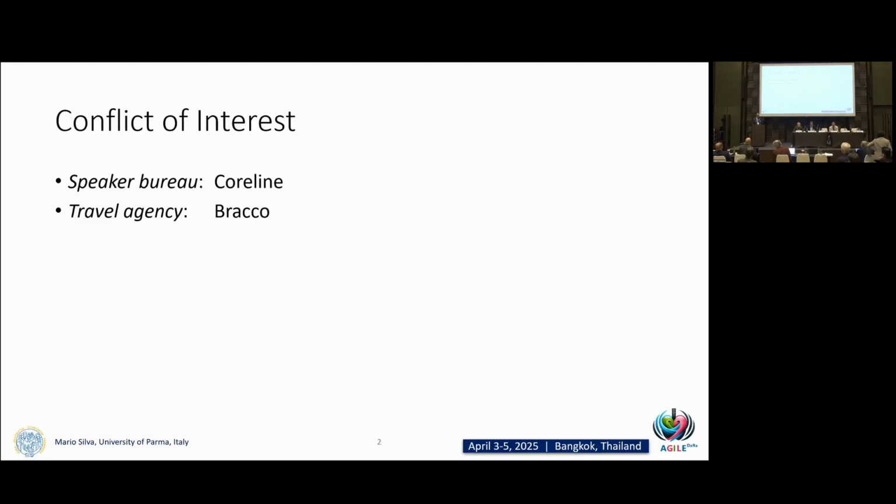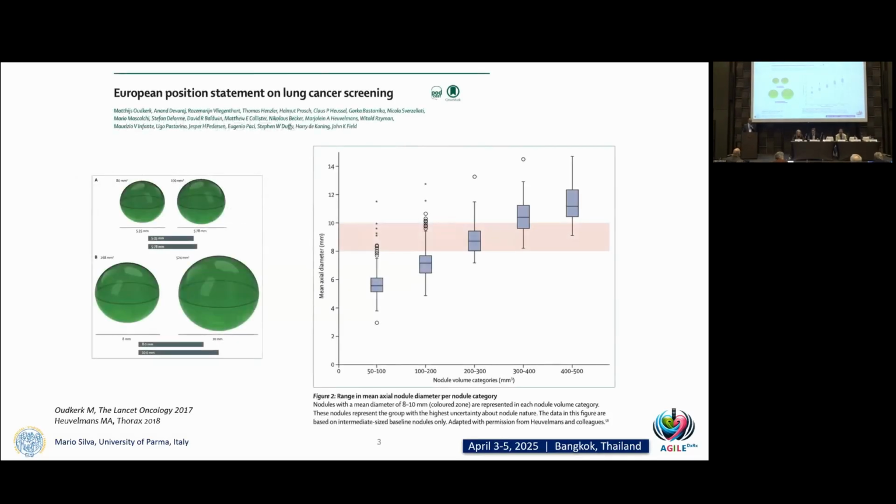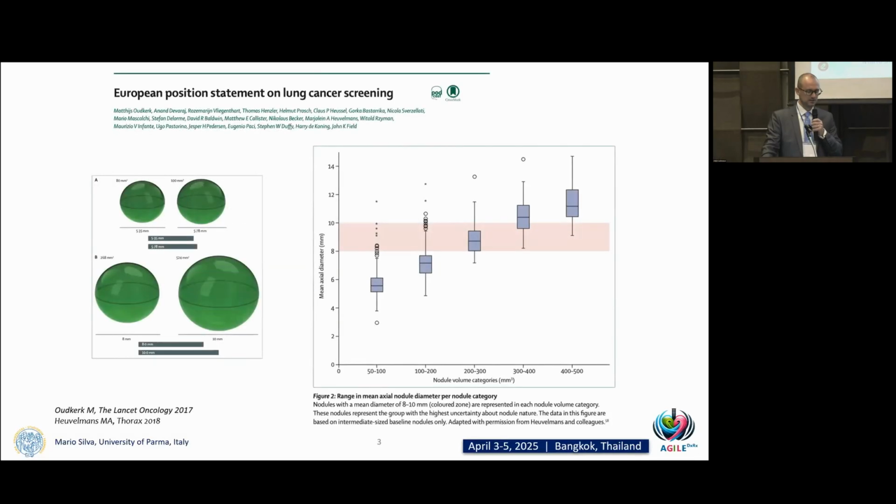So we've heard about volumetry already and standard for quality assurance doing low-dose CT. So I'm not talking about the low-dose CT protocol to operate with an appropriate volumetry, but I'm trying to stretch the concept of where volumetry is useful and where it is not.